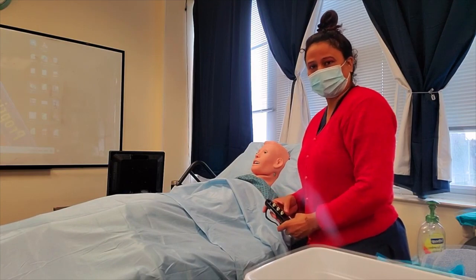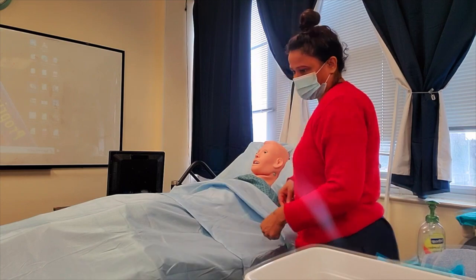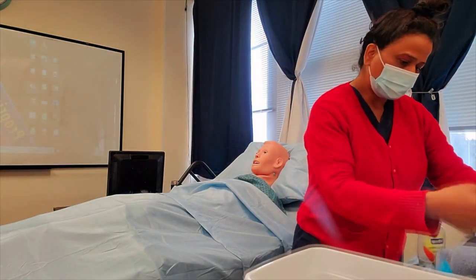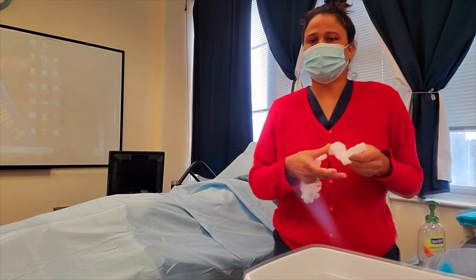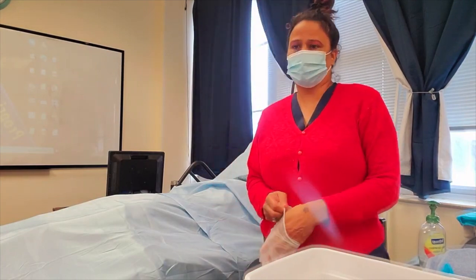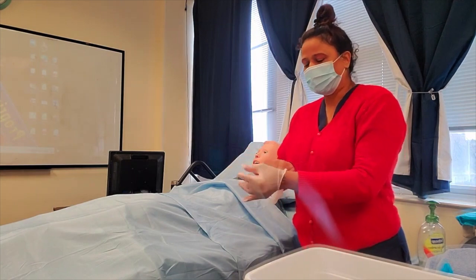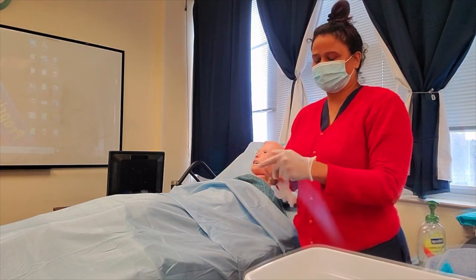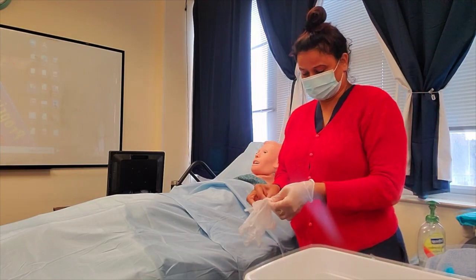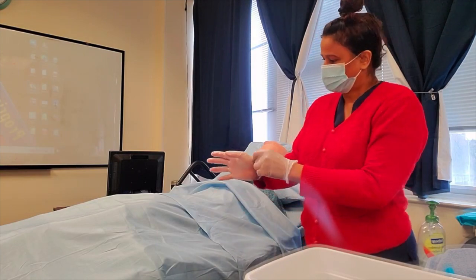I've raised the bed to working level to prevent back injuries and pulled my curtain. These are all indirect skills — introducing yourself to the patient, pulling the privacy curtain, locking the bed, and raising the bed to working level. These are skills you need to perform with every single skill you do.